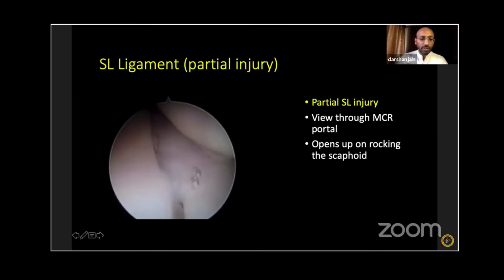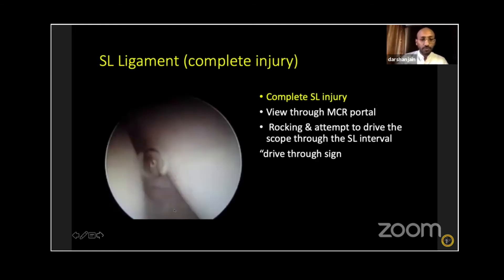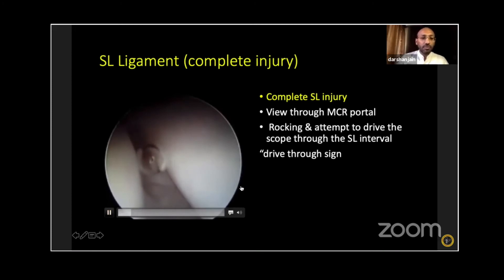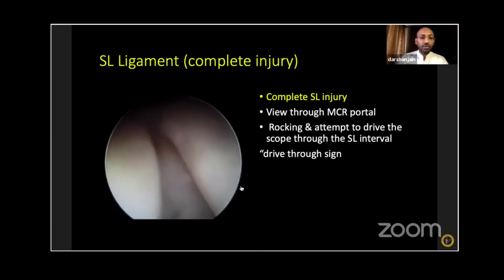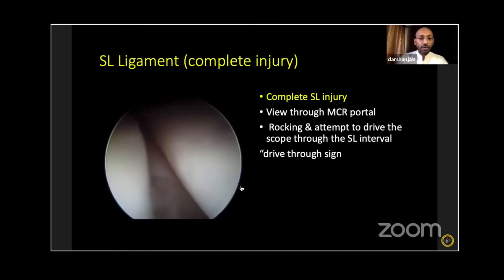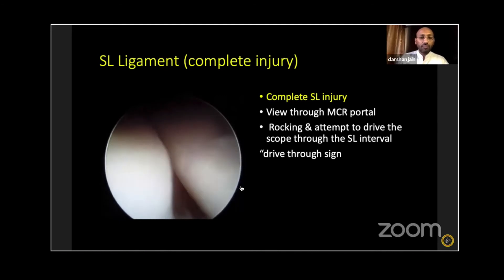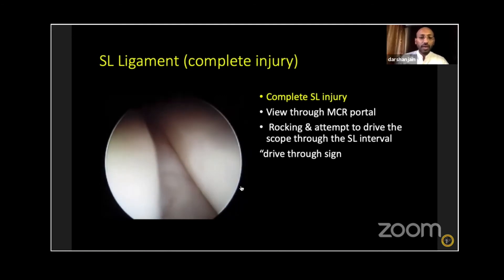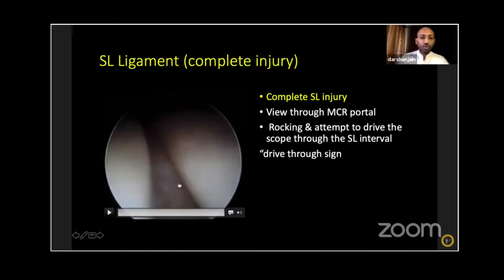Partial SL injuries are amenable to arthroscopic repair. A complete SL injury looks different — there are various grades. With a complete tear, when you try to rock the scaphoid and can actually drive your scope through the interval, that confirms a complete scapholunate ligament injury when viewing through the MCR portal.